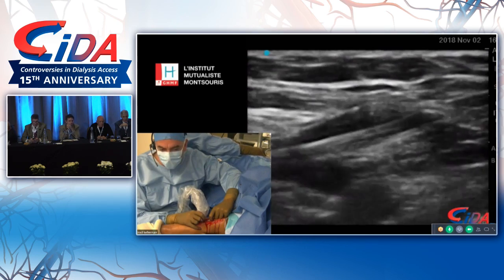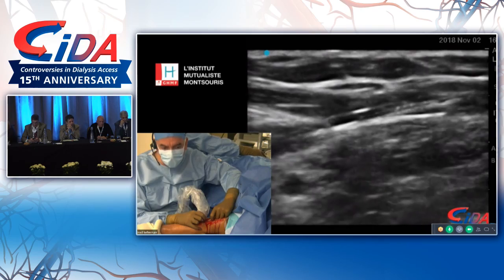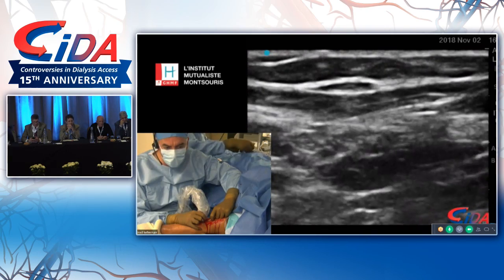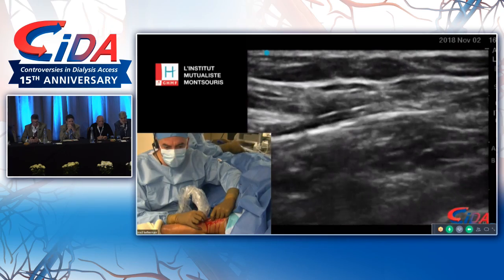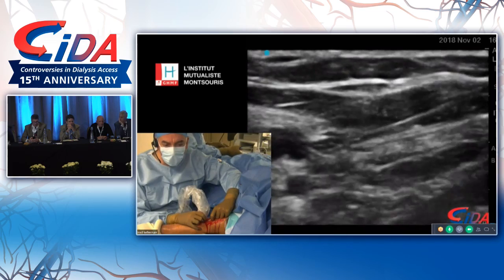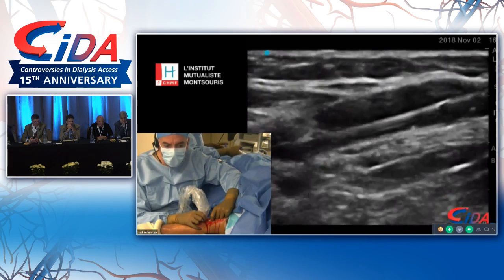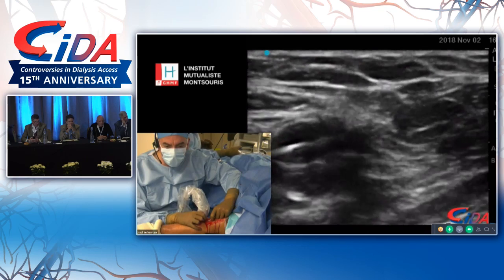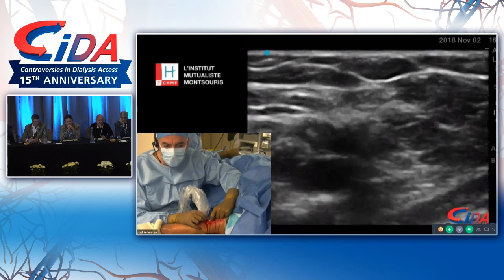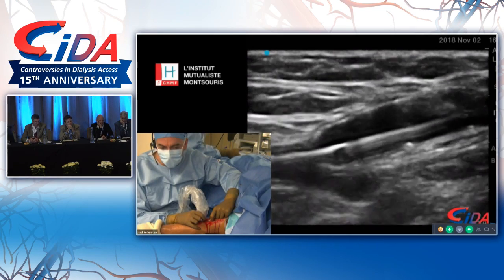Alex, you're now using balloon inflation of the anastomosis during each case? Yes, I'm doing it for every case. Reinflate, please. I'm doing it for every case because we didn't have any issues with it. We didn't have any ruptures. So there is only benefit that can come out of it because it will increase the maturation rates, and we didn't have any complications. So we don't see any reason not to do it.